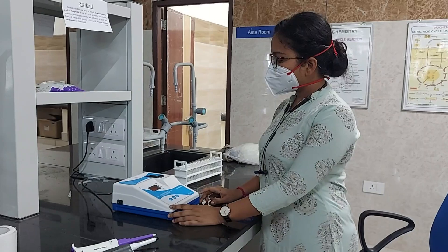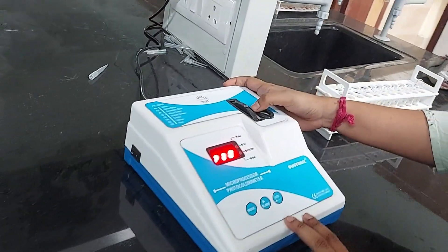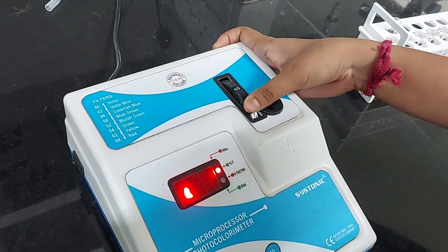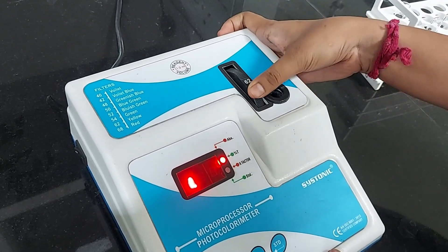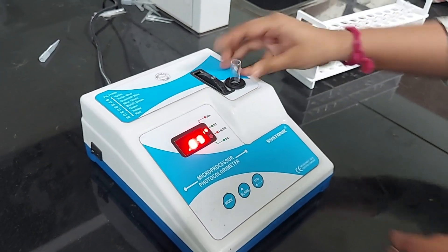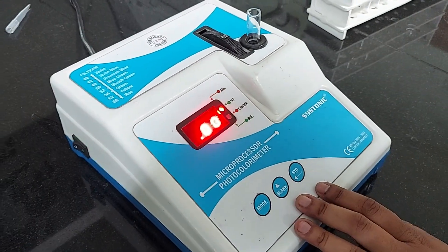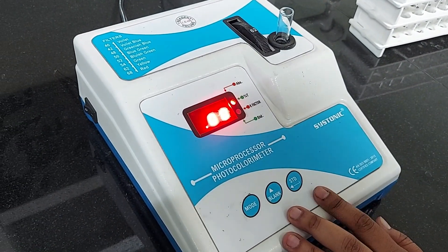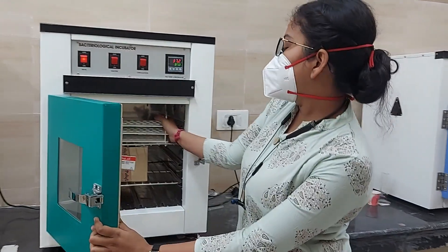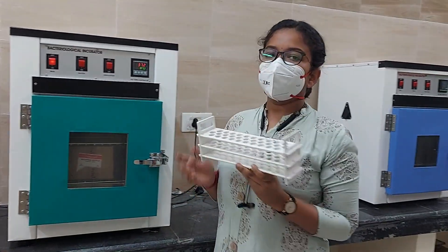Now we have to turn on the colorimeter machine. We have to set the filter at 620 nm. I am placing distilled water into the cuvette and pressing the blank button. The machine is showing 0 and working perfectly. Now 5 minutes is completed and we are taking out the samples for estimation.